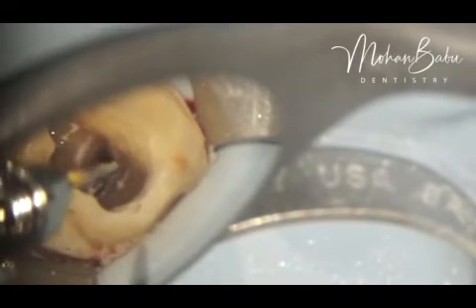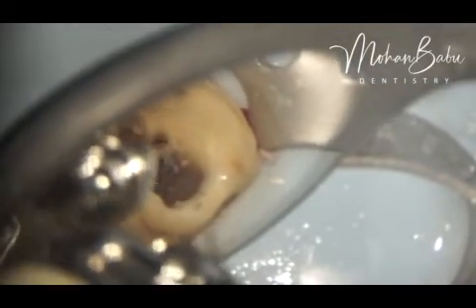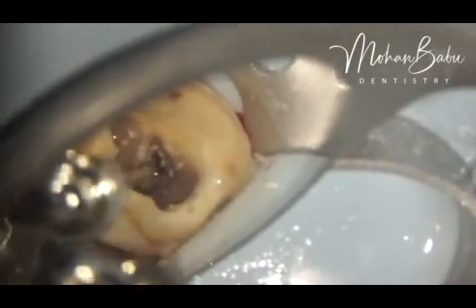Now we have to vibrate the fractured instrument in a counterclockwise manner with the help of the U-file. This is a challenging task because we are viewing the fractured instrument and using the U-file under a microscope in indirect mirror vision. Working in a mirror view and doing counterclockwise motion around a tiny instrument using another tiny instrument is really challenging — sometimes we go in the wrong direction. We can do some trials outside the canal and then repeat inside the canal.